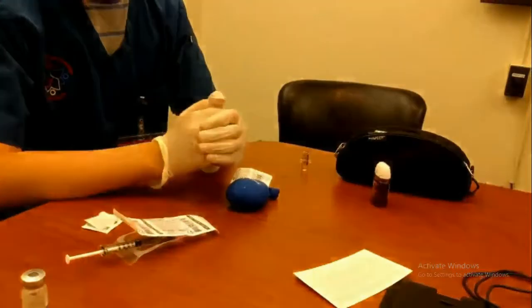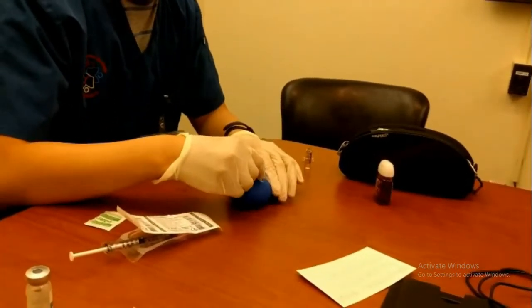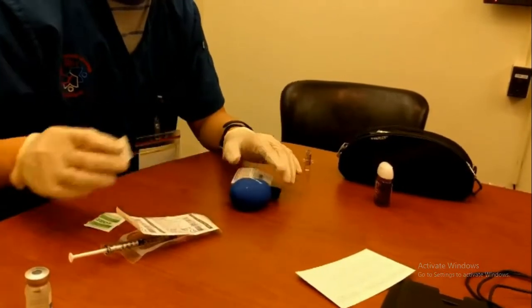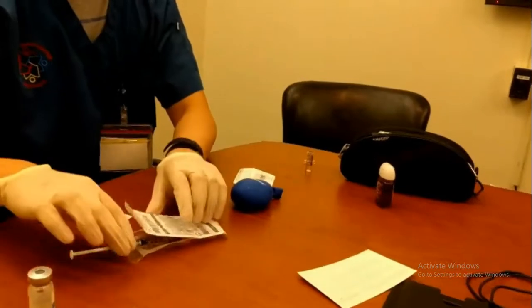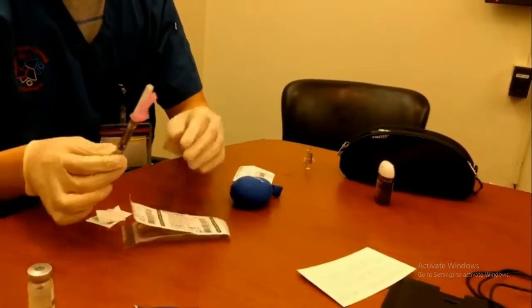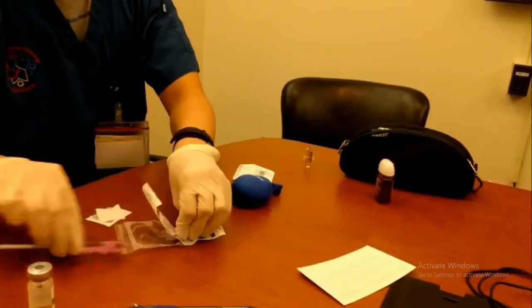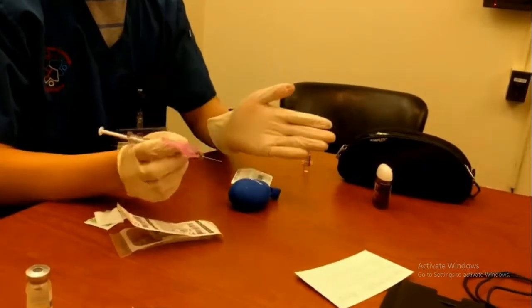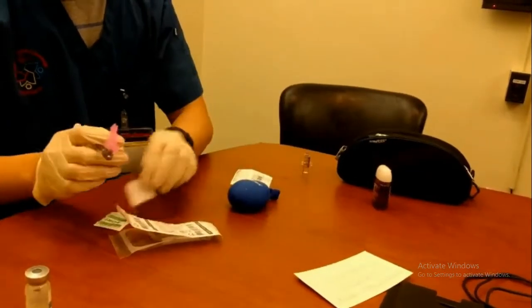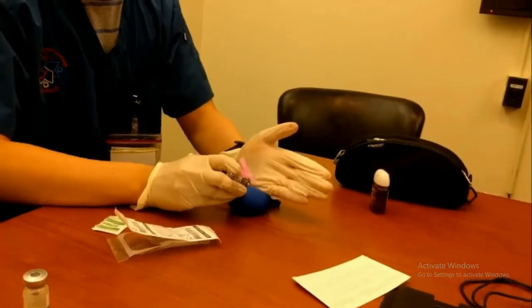Okay, so for the IM injection, I will start by taking the alcohol swab again, going from the inside to the out, this time on the deltoid. So I'll allow that to dry as well. I'll be taking the needle out, retracting the shield, and taking off the cap. Okay, and then first, I will use the Z-track method after putting this in my fingers. So Z-track method like that, like so.